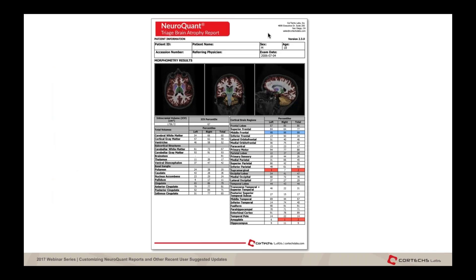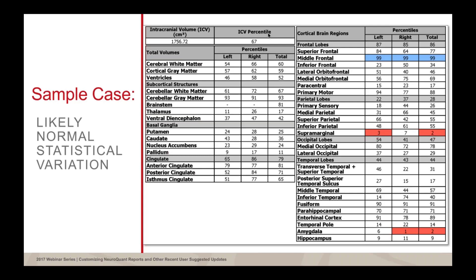The z-scores have been removed entirely. The outline of the report is effectively the same as before — color coding on the top saying NeuroQuant Triage Brain Atrophy Report, site information on the right-hand side, and now we are adding below that the version number of the report. So in our case it's version 2.3.0, then all the patient information below that. The cross-section through the hippocampus has not changed at all.